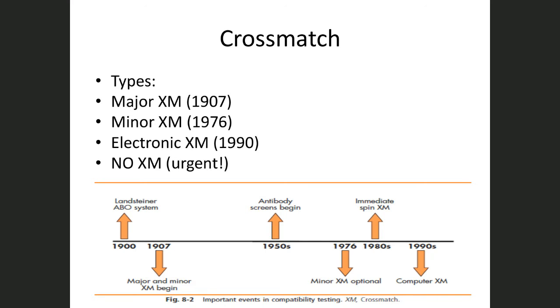So let's talk about cross matching. Okay, so cross matching, as you said, it's patient serum plus donor RBC. Okay, so we call this major cross matching. So in cross matching, we test the patient serum against donor cell.